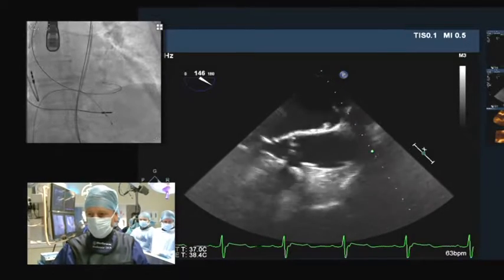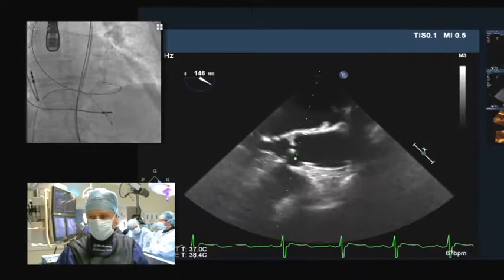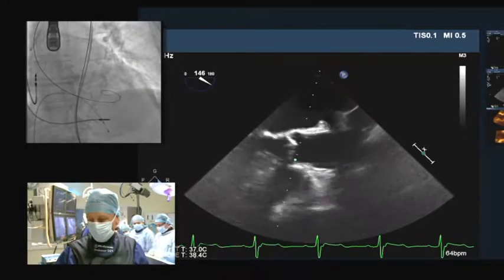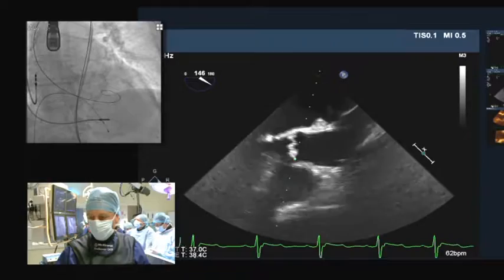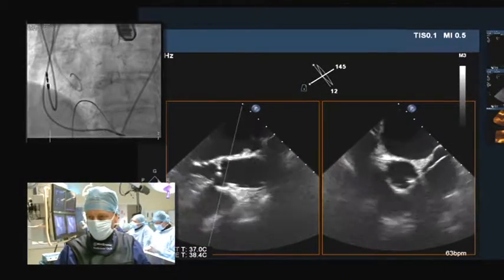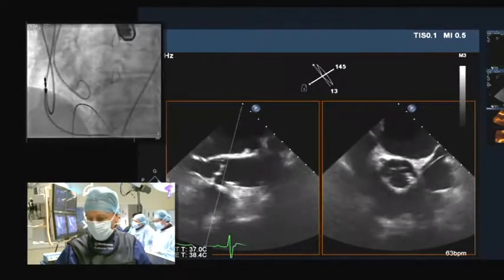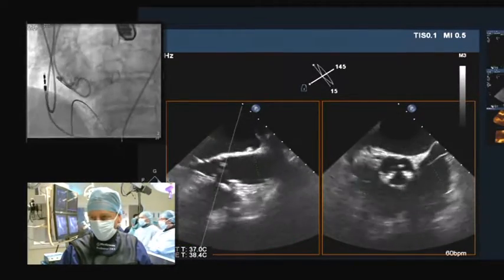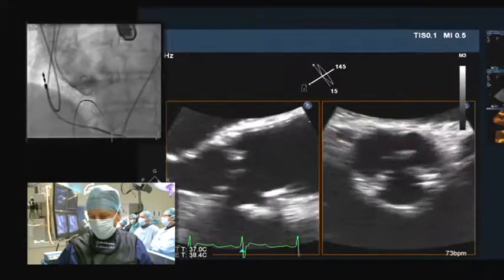One of the important things to do with this is to make sure that your transverse plane is at the level of the sinuses, because it's at that point that I want to see how the leaflets are fitting back. So you can see here I've chosen a transverse plane which is running across the sinuses, so we're just above the valve leaflets. If I move it down, you can see there are the valve leaflets. I've just come back up above it a bit. And we'll zoom in on this as well, so we have optimal resolution.